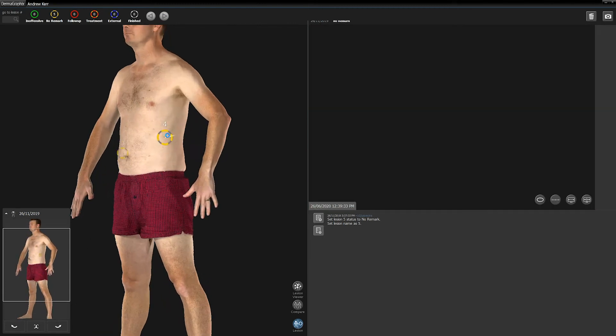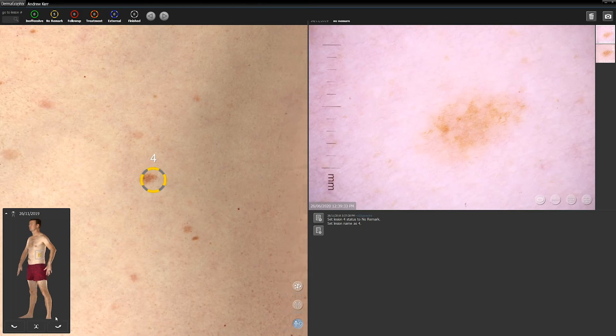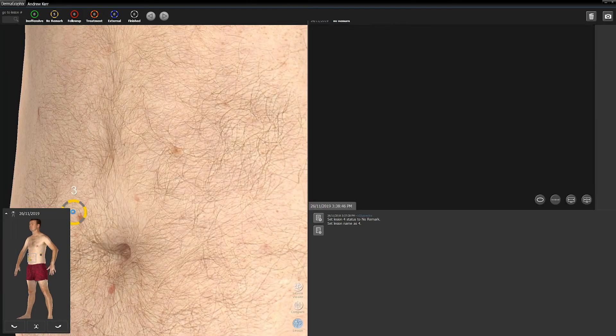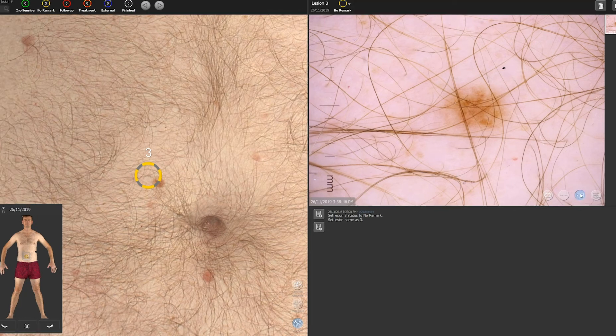You may click on a circled lesion marker to select a different lesion to view. To assess a dermoscopic image in greater detail, select the wide view icon. To assess dermoscopic images from different time points side by side for comparison, select the split side-by-side icon in the bottom right corner of the screen.